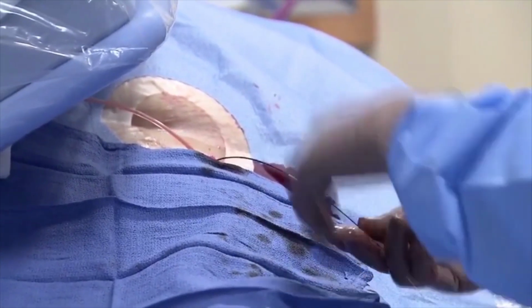John, or Dr. Tonkin, has already advanced his catheter and wire from the right side of the patient over to the patient's left. And now what he's doing, if we can look at the live fluoro, he's advancing a guide wire down the patient's left superficial femoral artery. And we'll see it here in a minute.